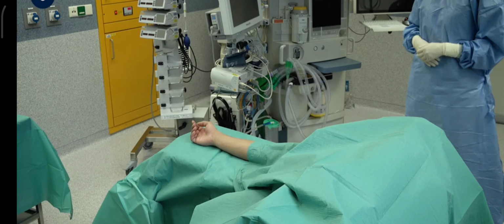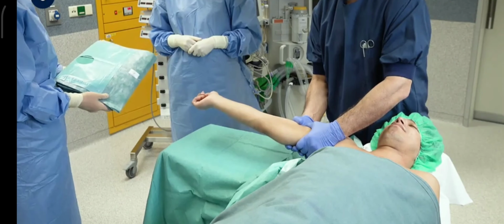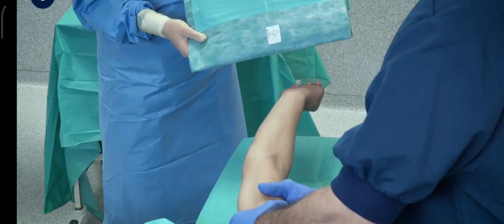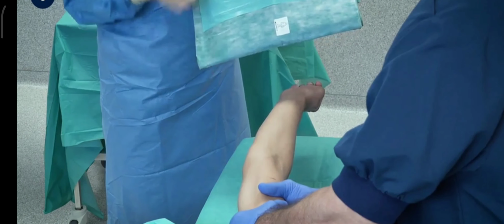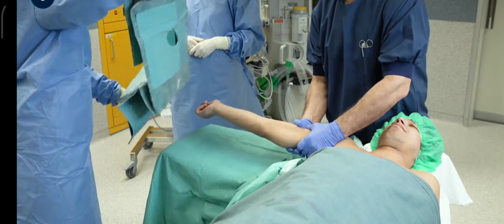An alternative to this configuration is an extremity sheet. This sheet can be used on the upper limb or lower limb and is positioned as follows. One side of the sheet is labelled, indicating which side should face the patient. With the correct orientation established, the sheet is unfolded, again with care taken not to cause any contamination.